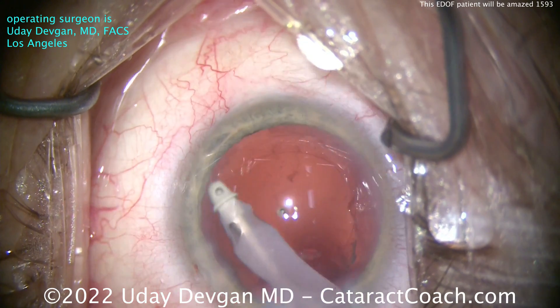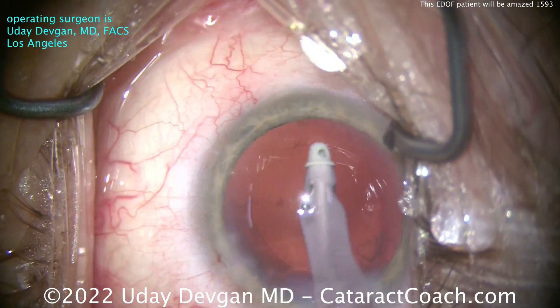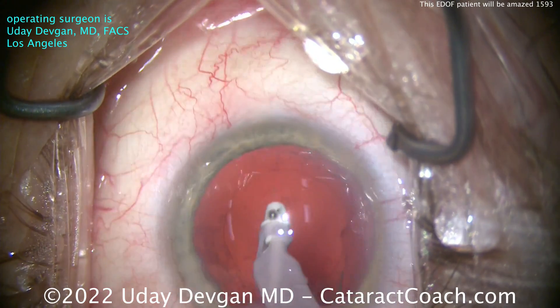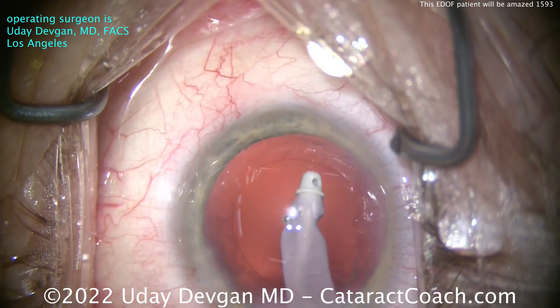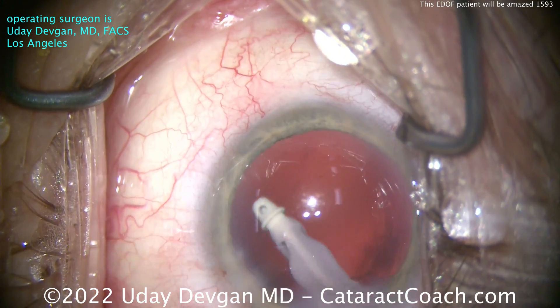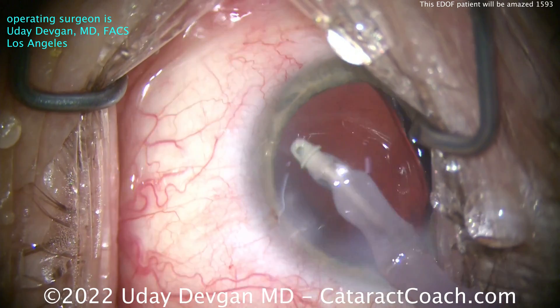Polishing up the capsule here, cleaning it up nicely, then getting that lens in. I'll show you how I center up the lens. The patient also has a very normal mild angle alpha kappa — everything's going to line up beautifully — so we just want to get that lens centered up on the visual axis. This surgery was about a month ago and the patient has had a fantastic outcome. Patient is absolutely pleased.